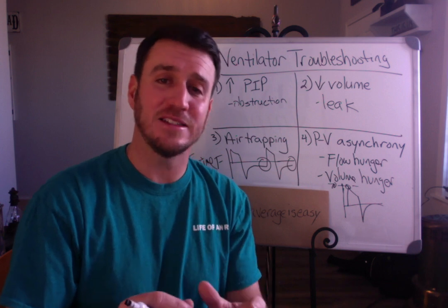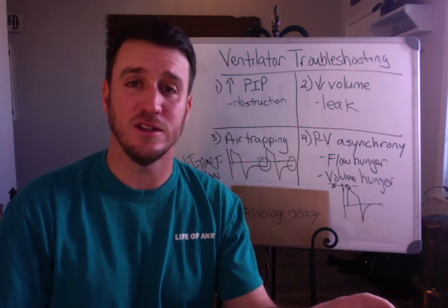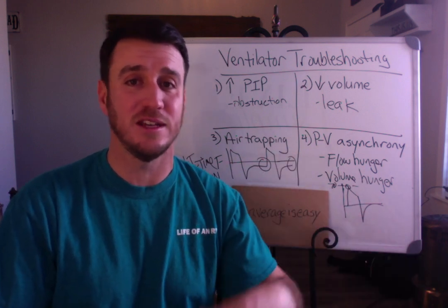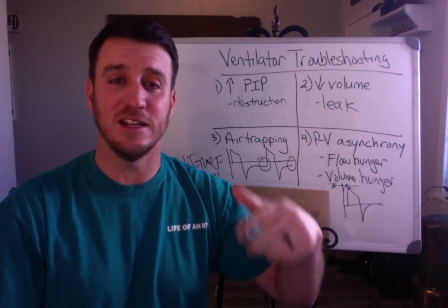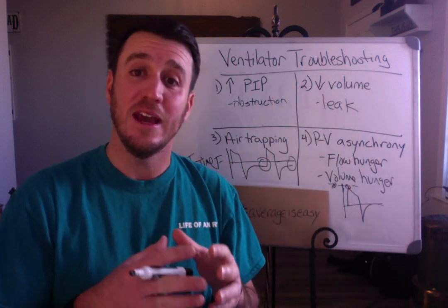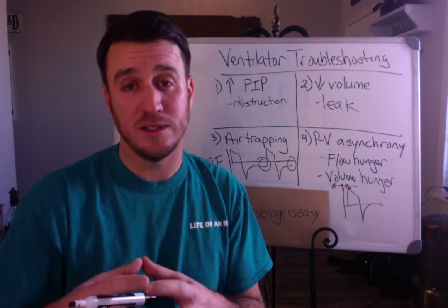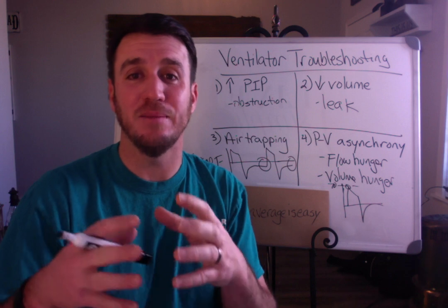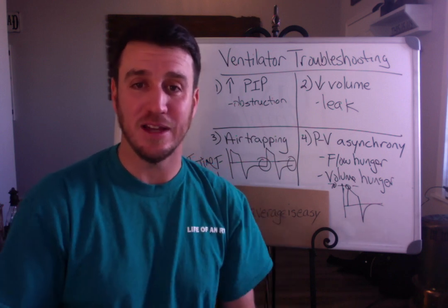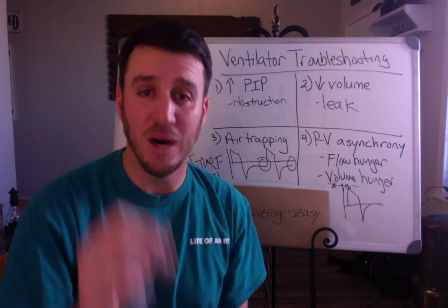Now, the last thing and the last resort is to give more sedation. There are several studies and a lot of research out there that say increased sedation leads to increased ICU psychosis, and all of that should be avoided. And if we can make the ventilator do what the patient wants instead of trying to make the patient do what the ventilator wants, your job as a respiratory therapist will become much easier.